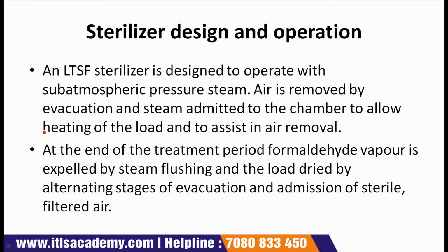Next point is, at the end of the treatment period, formaldehyde vapor is expelled by steam flushing and the load dried by alternating stages of evacuation and admission of sterile and filtered air. The sterilization period starts with the release of formaldehyde.